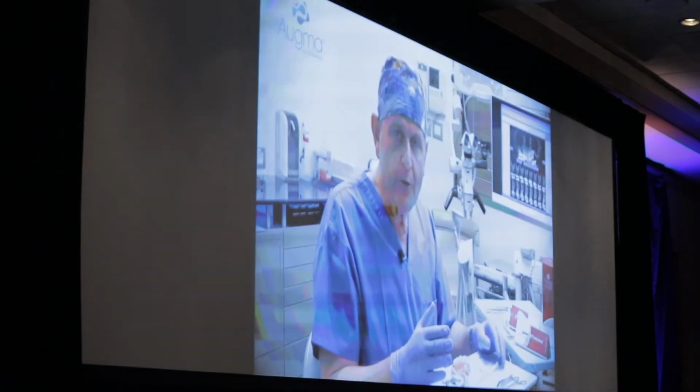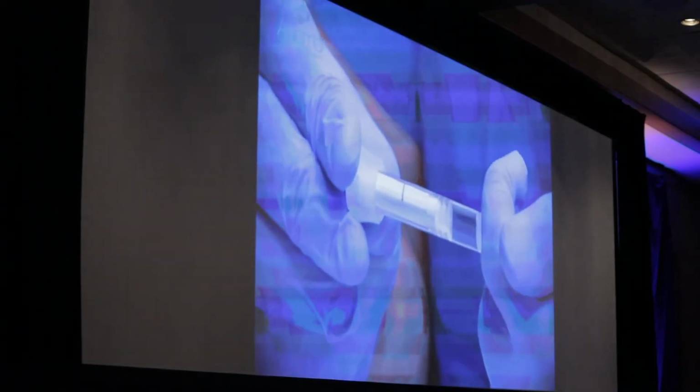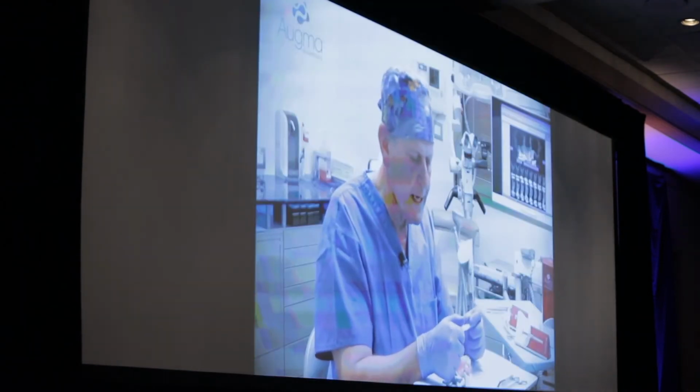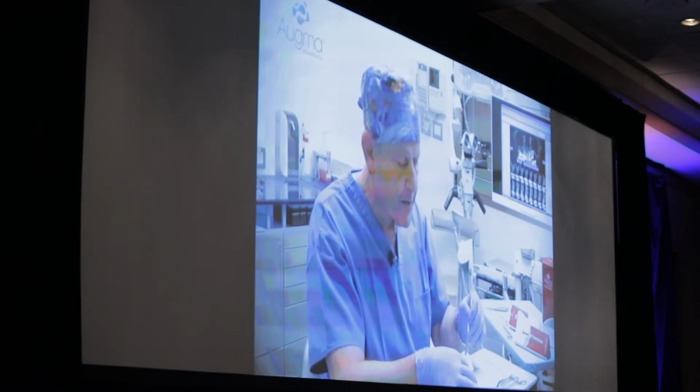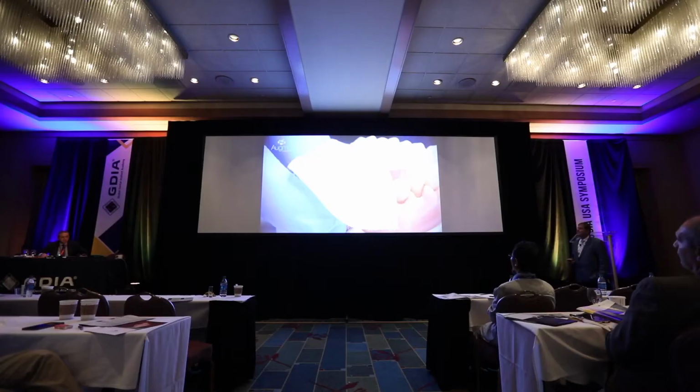Now, I would like to demonstrate how to work with bone apatite for the socket preservation technique when you don't reflect the flap. Press the shaft against the palm of your hand until the first piston reaches the blue line. Now the material is already activated. Remove the syringe head, approach the socket site, and eject the material into the socket. Slightly overfill it, and now you take a dry gauze and press the material firmly into the socket. If there is not enough room for your finger between the teeth, use a spatula or an elevator and press over the dry gauze.